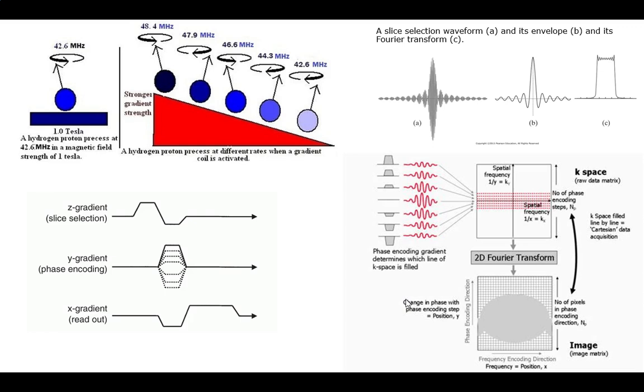And what you're really doing there, it talks about phase encoding. It doesn't really show it as well here, and that might not look like phase to you. But what you're actually doing when it's talking about phase, it is kind of phase in one sense. But in particular, remember we talked about the phasing, dephasing of all the tops, how they're spinning and the net effect of it. That's what you're actually perturbing. And in different areas, you're setting the phase of it.